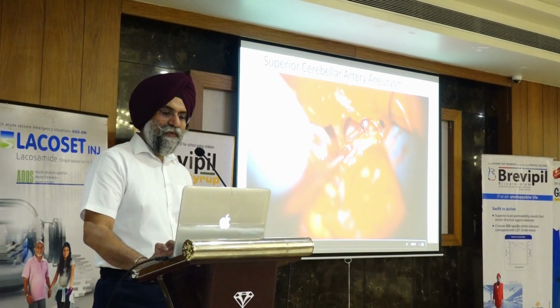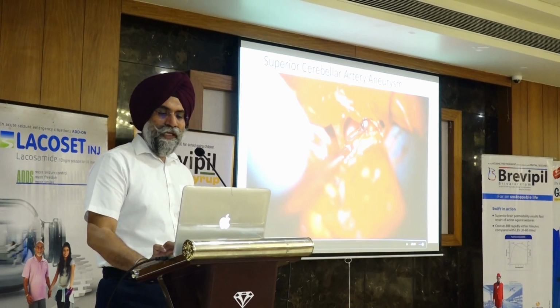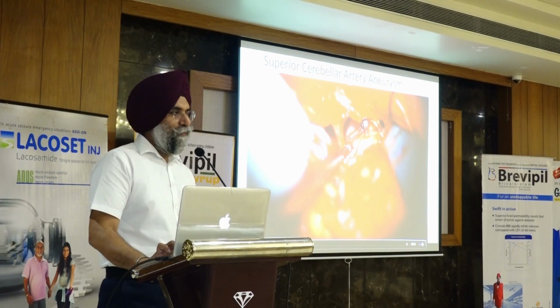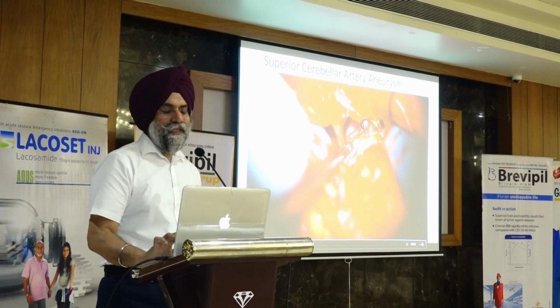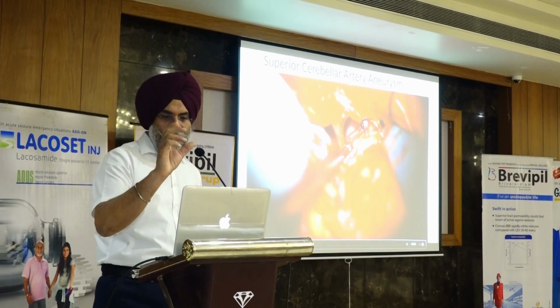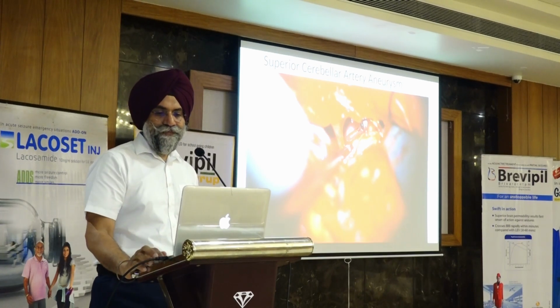So if we have a difficulty in reaching down to the basilar trunk, what we can do is that this is the area of the posterior clinoid process. We can drill out this much of bone. Now we know that this is the third nerve. We can medialize or lateralize depending upon your surgical corridor and approach. We can drill it out with the help of a pneumatic drill, but I would recommend that the bone Cusa is a better tool, so that it doesn't move, it only vibrates and shells off the posterior clinoid very nicely without much fuss, and you can go down to the basilar trunk.